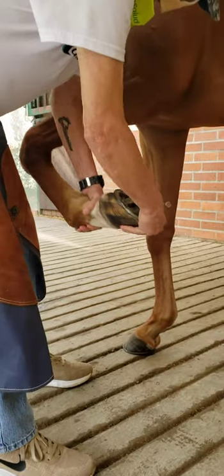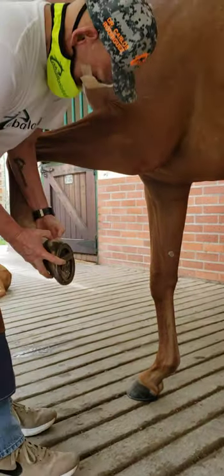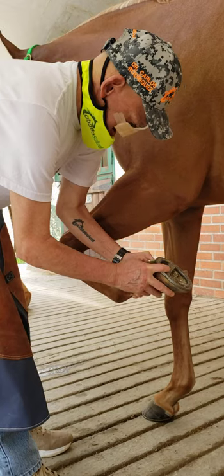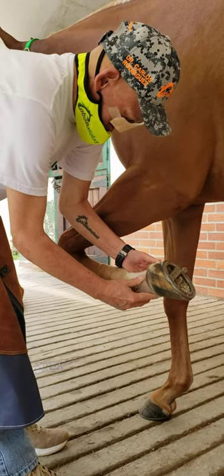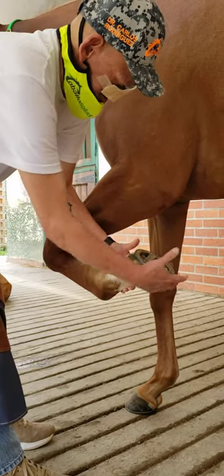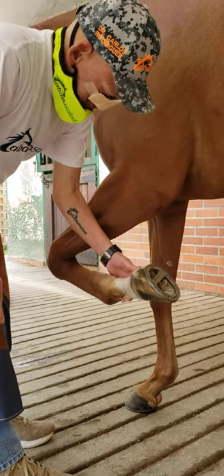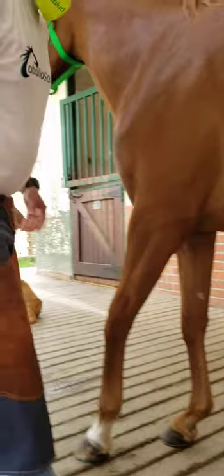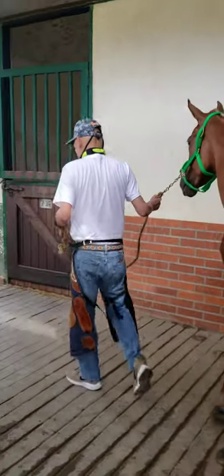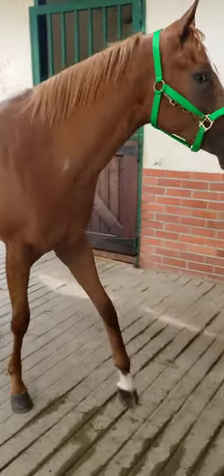I'm going to double-check again to make sure. And yes, there is pain in the lower limb — there is pain in the low and there is pain in the interphalangeal joint. So I don't think the hoof issue alone is very much related to the big pain that this beautiful mare shows. She can barely walk — too much pain.